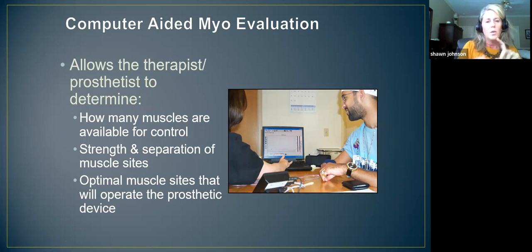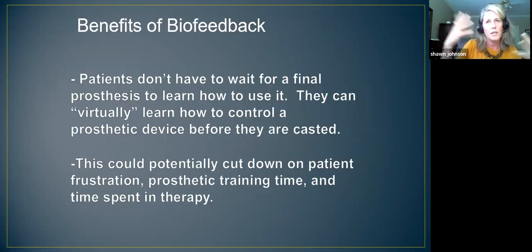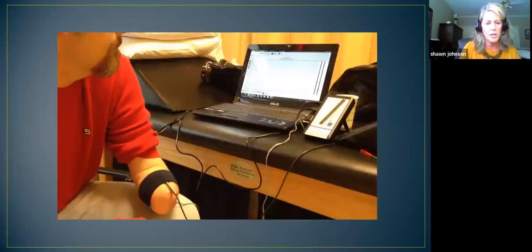And so what I found when I saw that this device was at the prosthetist that I worked with 20 years ago, I was like, why don't we have that at our facility? Then we could tease out the problems prior to them even getting a prosthesis. We could train them how to use it prior to them even getting cast. They don't have to wait for a final prosthesis to learn how to use it. They virtually learn how to control the prosthetic device before they're casted. So I really feel like this cuts down on patient frustration, training time, and time spent in therapy. Ultimately, if you have a therapist in your area that's willing to do this prior to fit with the prosthesis for a myoelectric setup.